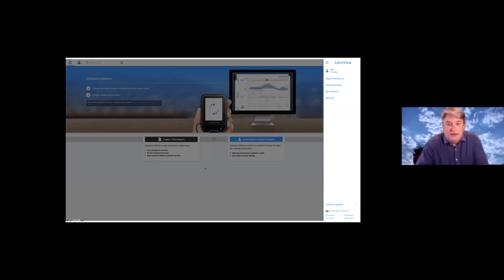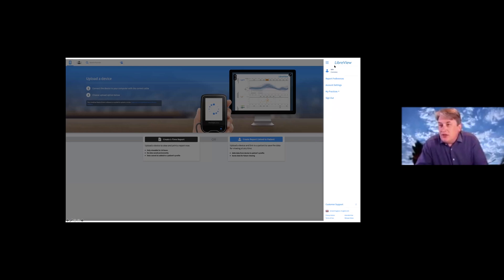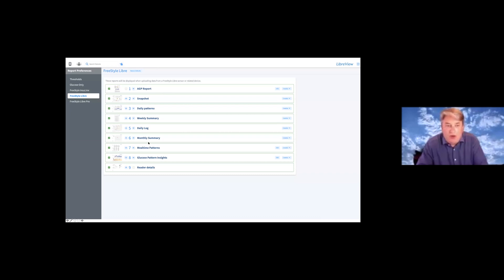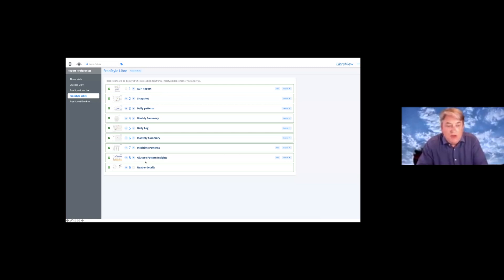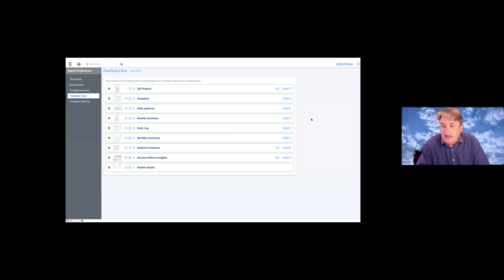Looking at the menu screen, we have a number of options. The first is this idea of changing preferences on a report — and it's worth a quick look, because there are many ways to look at data. We can select which ways of looking at data we like to see routinely, uncheck boxes, and order the order of reports. I tend to look at overview data first, then individual day data, looking at the weekly summary, then the daily log.